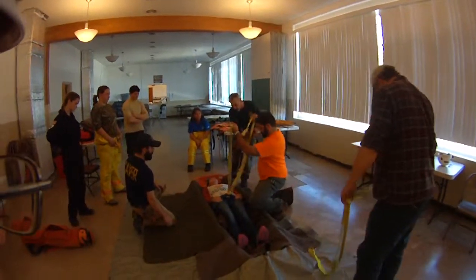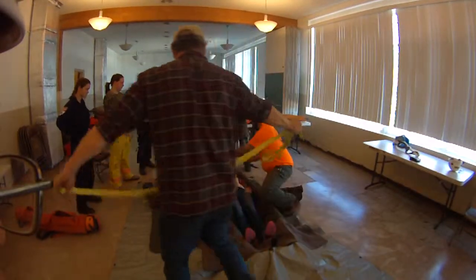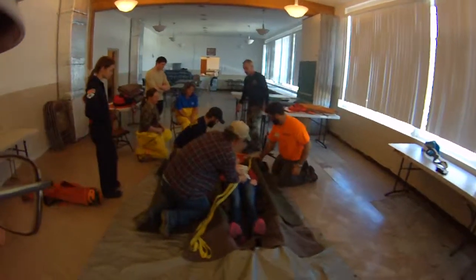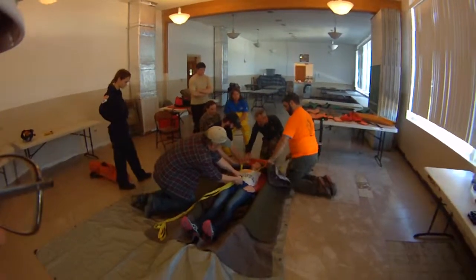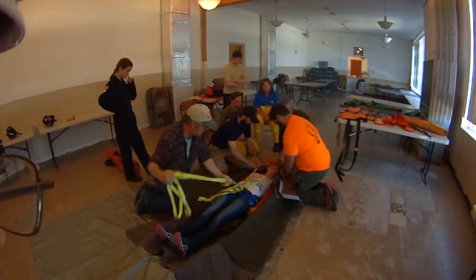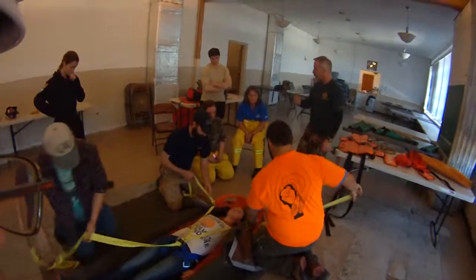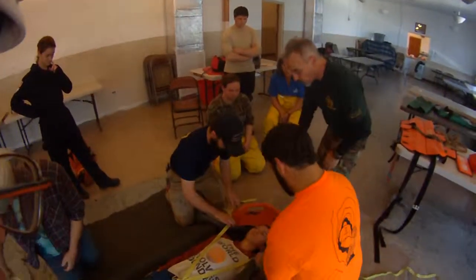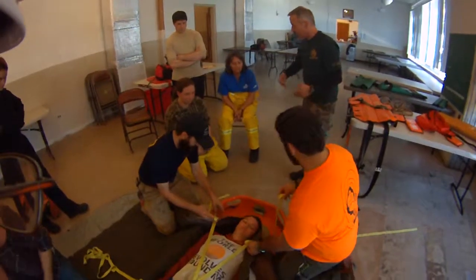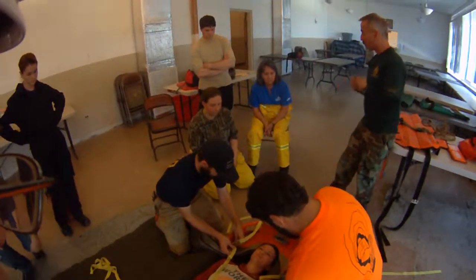Then we will put her in the litter. Always be careful of webbing near their face. What you want to do is perfect it at the top — you don't want to fasten it up here because then it comes real close to her face. You don't want that. So then we fasten it down here. You want the top one to be loose. The top one is loose, the bottom one is tight. What we like to do is take two fingers — just like that — because that ensures that it will be loose. For the ones on the feet, we crank down a little hard.